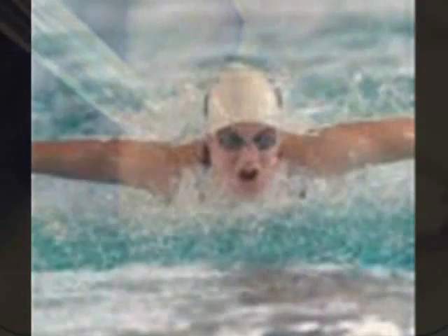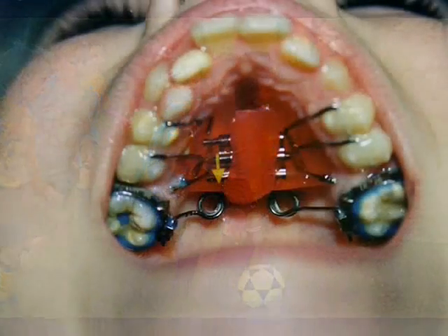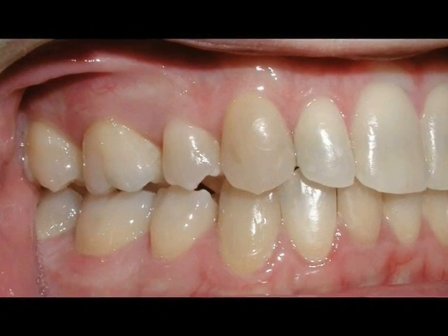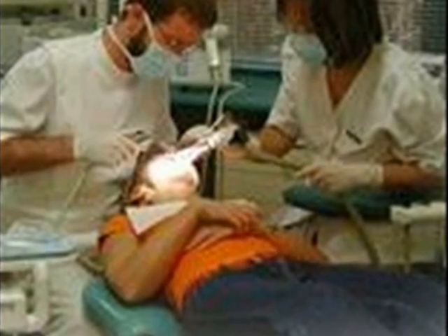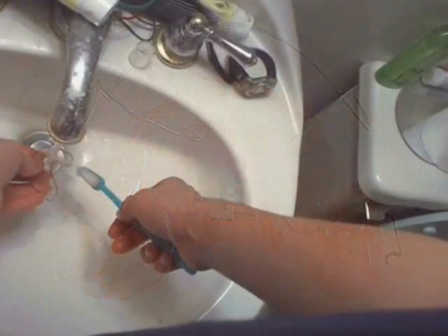It is usually worn full time for up to 1 year, except for when you eat, when you brush, when you swim, or when you play sports. Wear it at night for a further year. The corrected teeth are observed periodically for up to 5 years after the retainers have been phased out. During retention and subsequent observation period, you are expected to visit your orthodontist once or twice a year. But make sure that you wear them as directed and keep them cleaned thoroughly. Handle your retainer with care as it is easier to lose but expensive to replace.